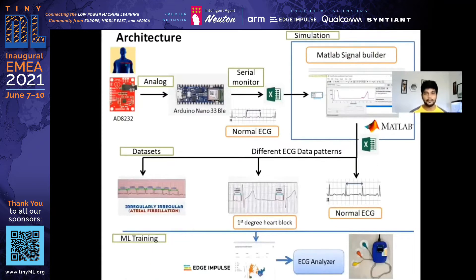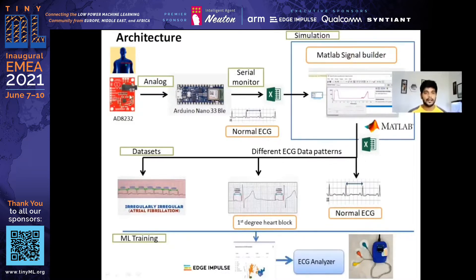This is the overall architecture and flow of the project — data acquisition, simulation, modeling, and deployment. I used an ECG sensor AD8232 connected to the analog input of the Arduino Nano 33, and I collected my own heart ECG readings, copying them from the serial monitor into Excel data.